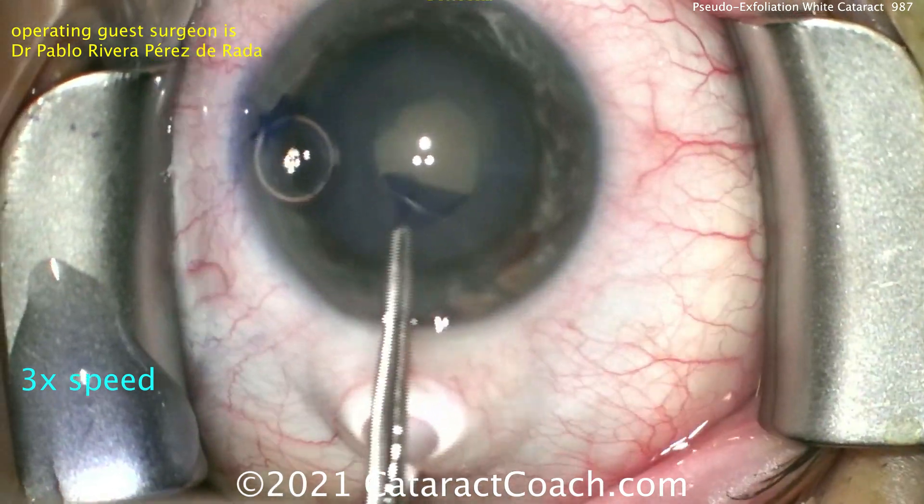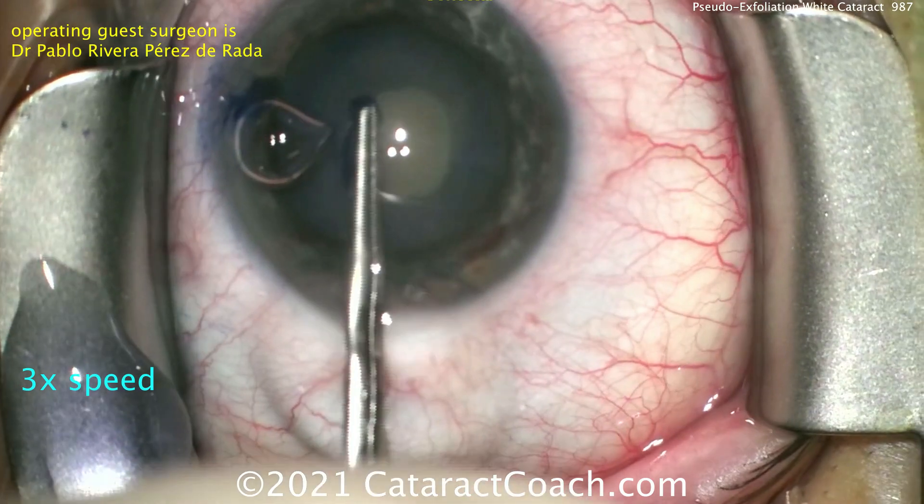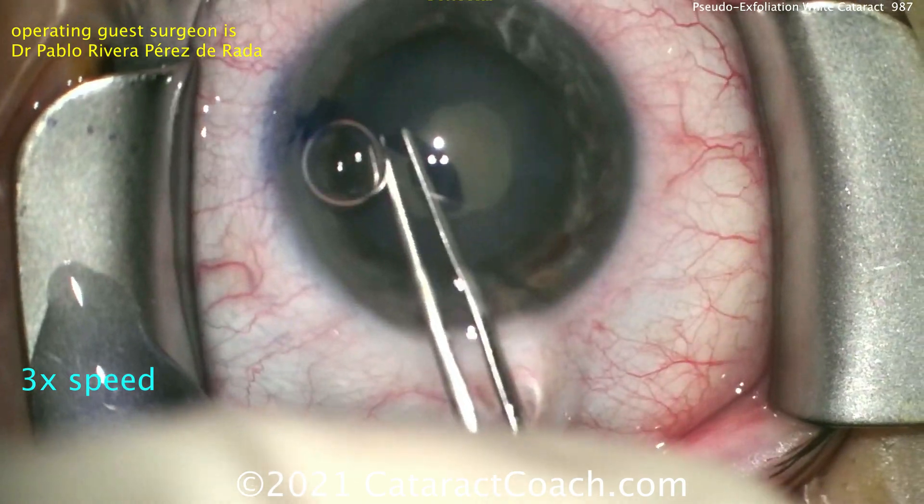So instead, we can go right to the forceps and create a capsulorhexis. Now with the Pseudo-Exfoliation eye, we definitely don't want a baby rexis. You want to have at least a 5mm capsulorhexis, and this looks pretty good.